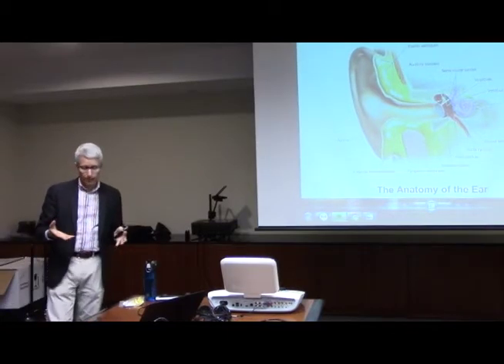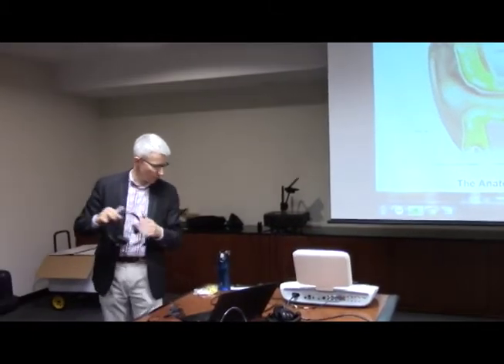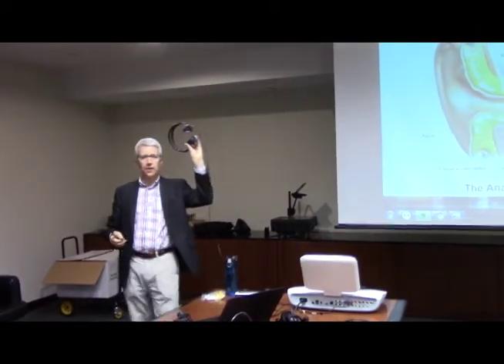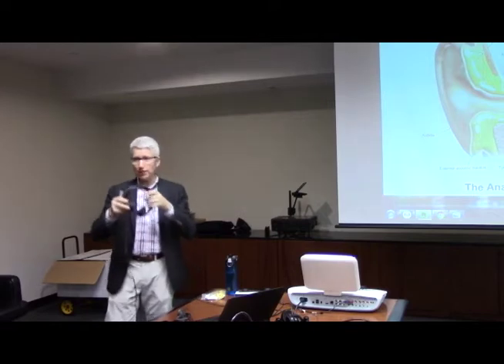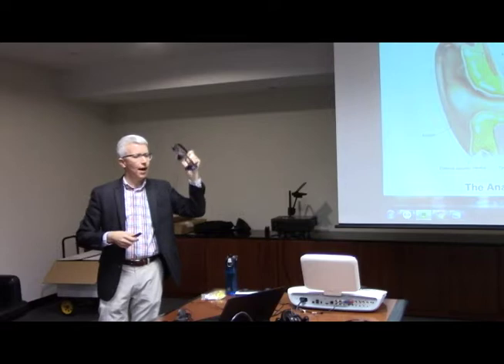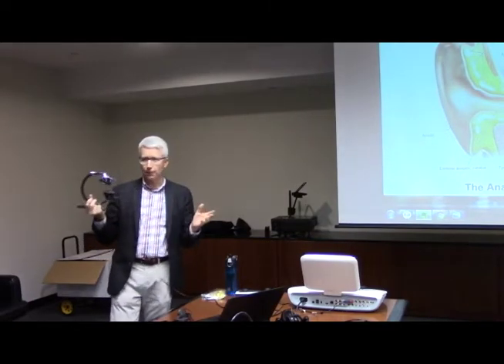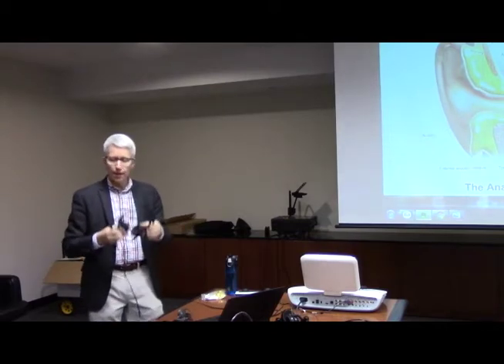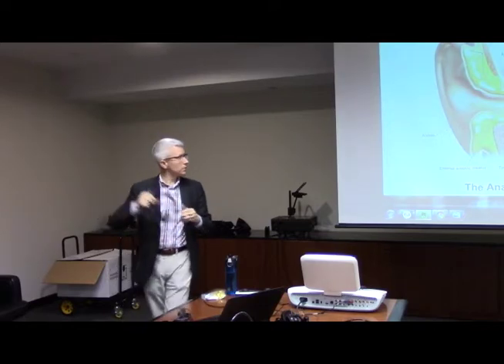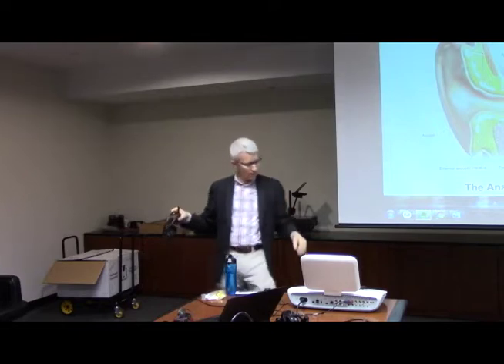So when we do a hearing test, as many of you have either had done or are at least familiar with, the term is headphones. These are headphones that we would use for a hearing test. You're going to notice that pretty much everything has red and blue, just like our logo. That was not a mistake. Red is for the right ear, blue is for the left. So everything's red and blue, just a standard color coding. These are general headphones connected to the audiometer, which is going to present tones. The headphones are going to sit out here, present that acoustical sound, and go in there and stimulate it.